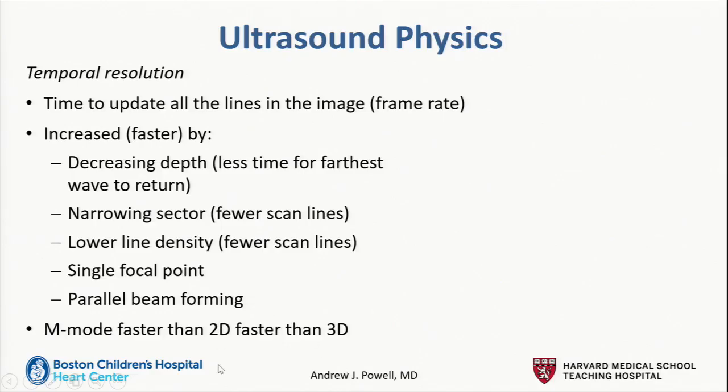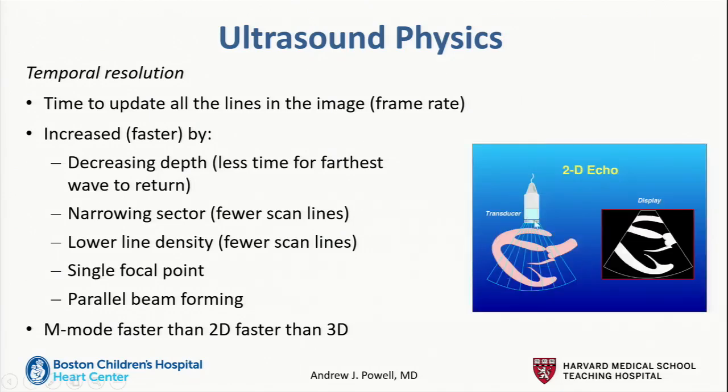And what I mean by that is we're now talking about 2D imaging or 3D imaging. It's how long it takes the machine to draw that single picture before it updates and does another point of time. So again, we're back to, let's use a 2D example here. Remember, to draw this picture, what it's got to do is it's got to sample each and draw each of these individual scan lines.